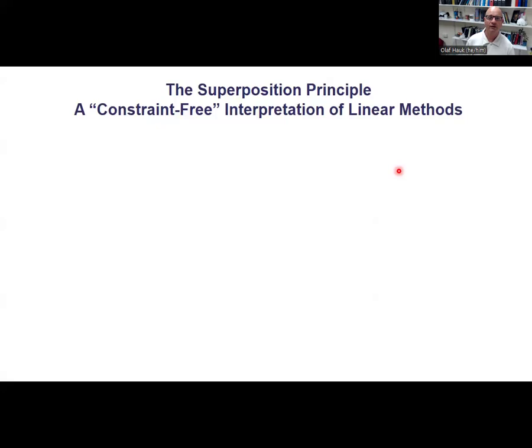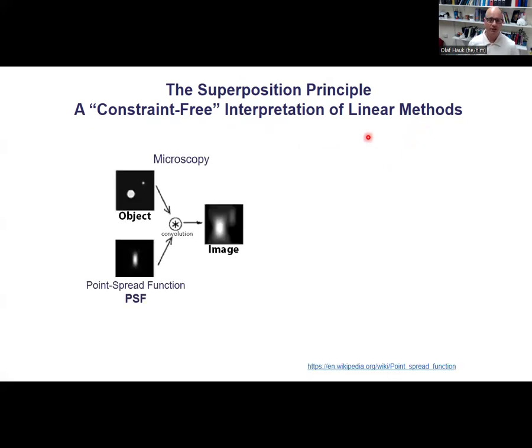So one thing that is important, at least when you are using linear methods to approach the inverse problem, is the superposition principle. And that's actually something that hasn't been invented for EEG and MEG analysis. It's actually used whenever people use linear methods to look at their data.